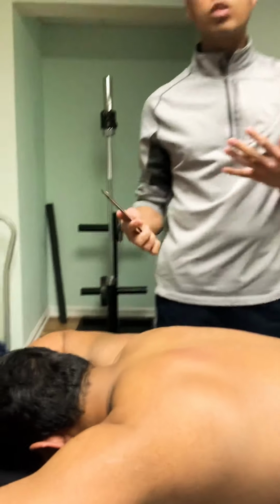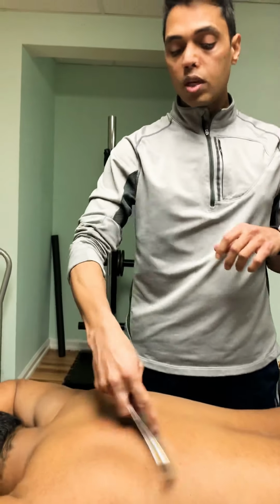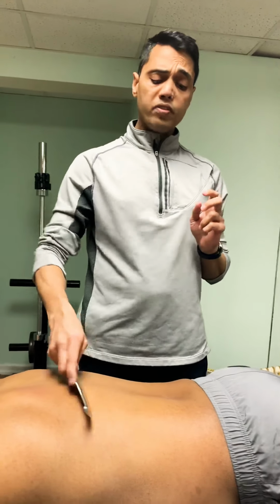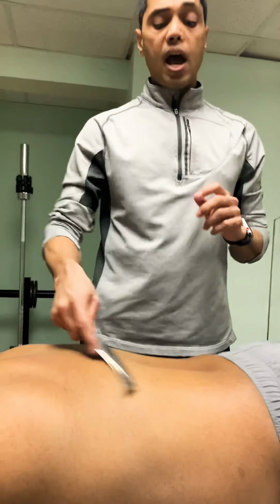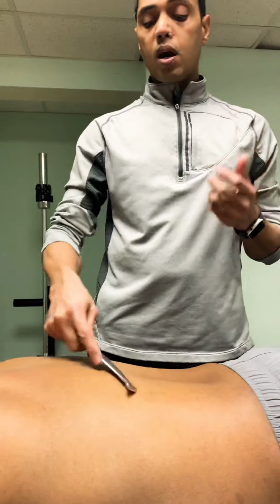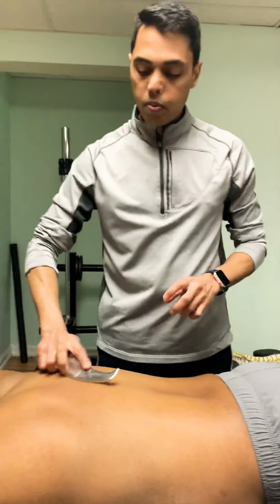But if I want motor control, or I want to increase sensitivity or pain, there's a different pressure and direction. If I want things to fire better, if they're not working well, I could go at a quick pace. As you can see, my speed is a lot faster. It's about 150 to 220 beats per minute, very fast, so I can excite the areas that are not working. If I feel this area is not very active, hypotonic, then I could use speed. But if I feel it's hypertonic and stiff and doesn't move, then the pressure is different, as you can see.